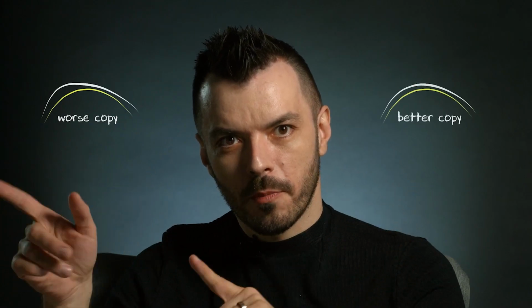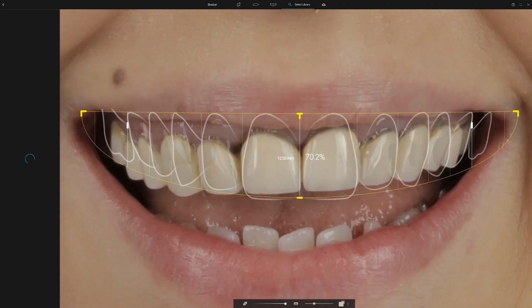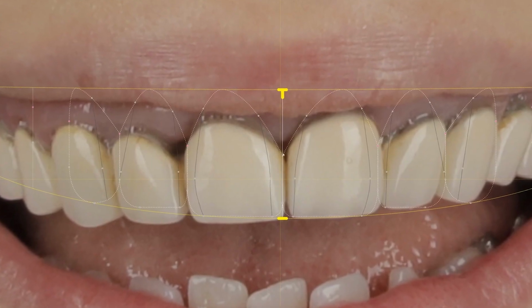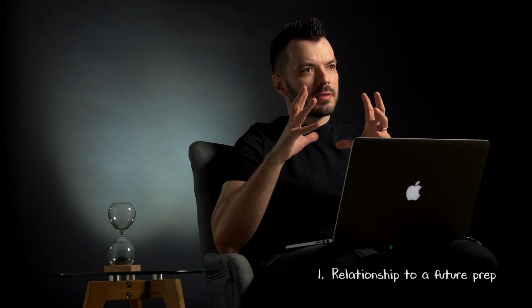Which means a very simple math here. The bigger the discrepancy between these two lines, the worse the copy. The smaller the discrepancy, the better the copy. Now remember that the shape is designed to fit this particular scenario. You have used SmileCloud, which means the shape has the right size, the right proportion, the right contact area, the right papilla height. Now when I'm placing this shape, I want it to be in close relationship to where I can place my future prep.